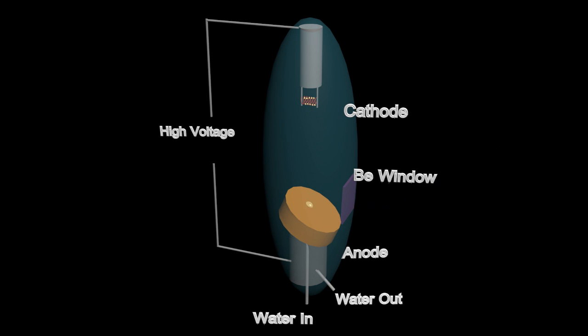Since the anode is heating up very quickly, it needs to be cooled down, and this is done with water cooling. As the electrons interact with the anode, the x-rays are emitted.